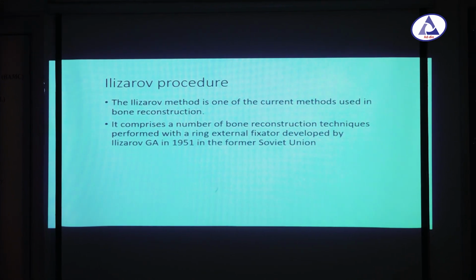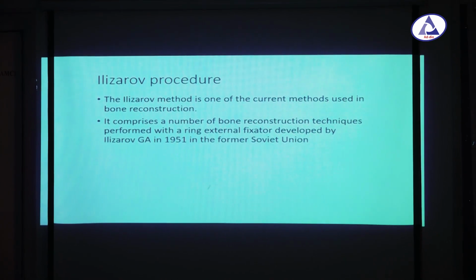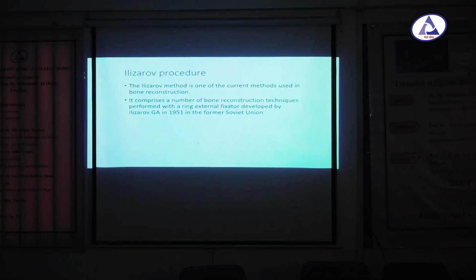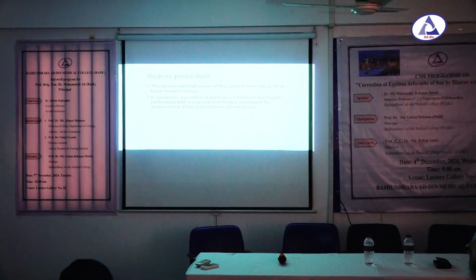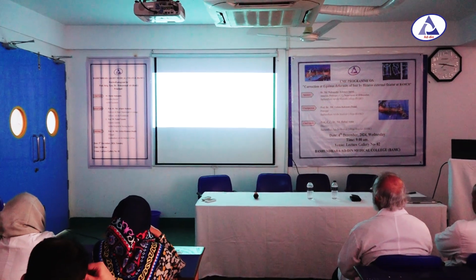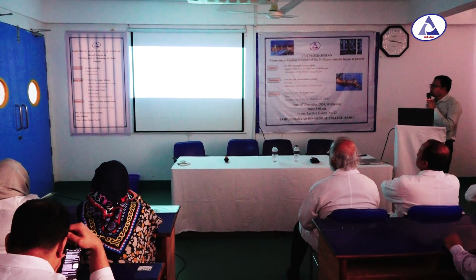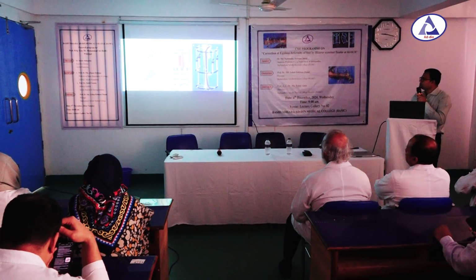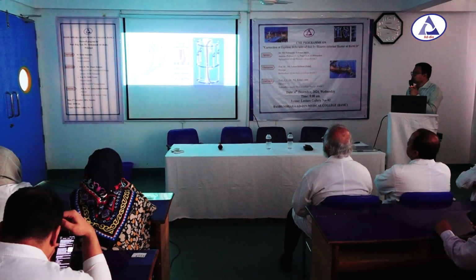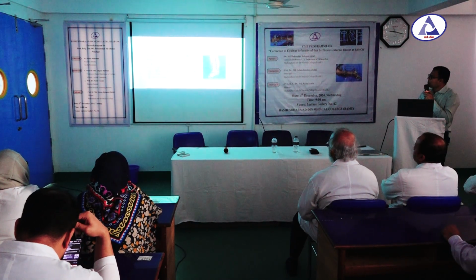And now the main topic we are discussing today, that is the Ilizarov procedure. The Ilizarov method is one of the current methods used in bone reconstruction. It comprises a number of bone reconstruction techniques performed with a ring external fixator developed by Gabriel Abramovich Ilizarov in 1951 in the former Soviet Union. And these are the different types of apparatus shown here to correct the deformities or help in reconstruction of the bone.